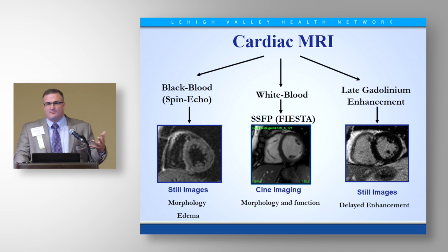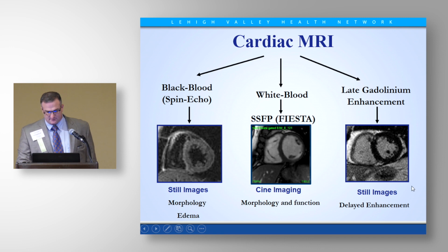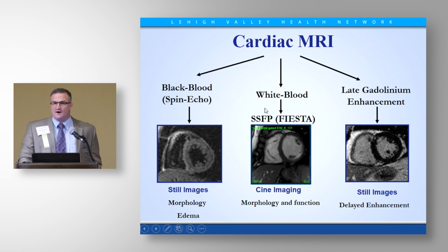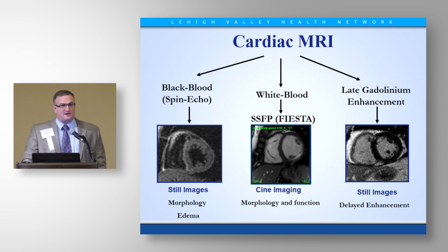So if you look at MRI, I break it up into three pieces. It sort of comes in three flavors, the first of which are these two here. Now, none of these require ionizing radiation. None of them require contrast. So the safety of these is pretty well established. Without contrast, we do this in pregnancy, we do it in young kids, and we do it in old folks. Everybody and everyone in between.